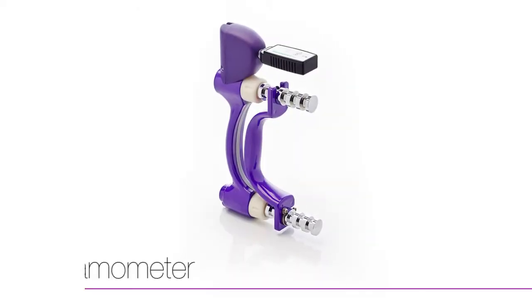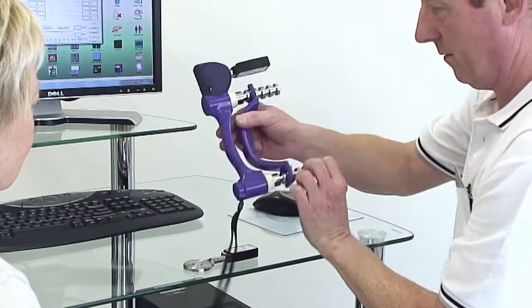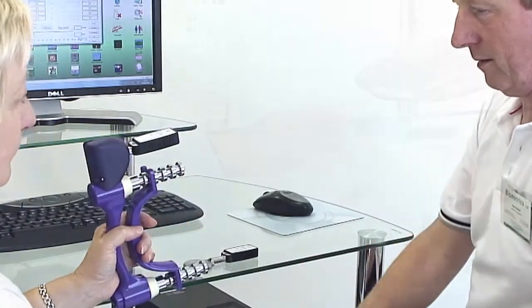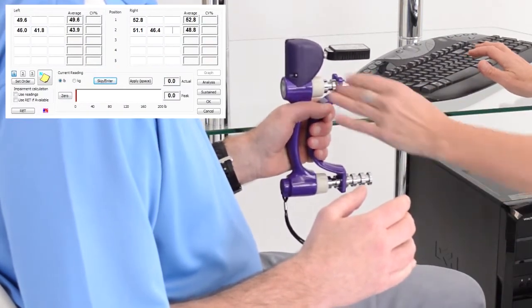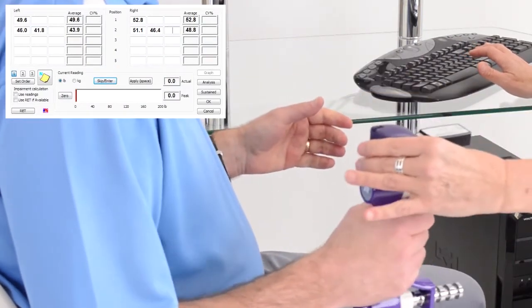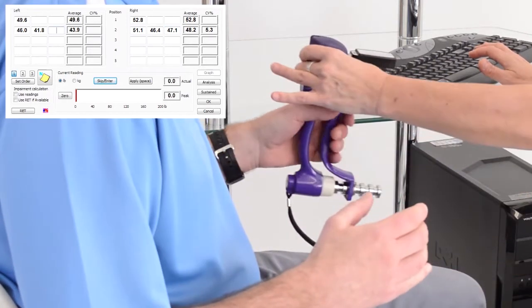The e-link dynamometer allows tests to be performed quickly and includes assessments that cannot be undertaken with a manual device. Standard peak force grip test with automatic calculation of the average also provides the coefficient of variation percentage for consistency of measurement.